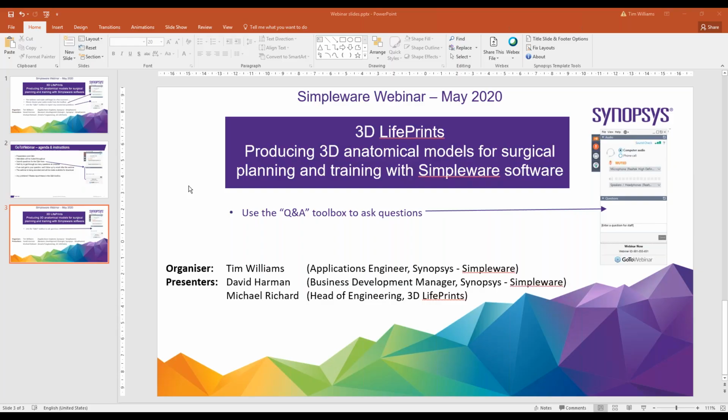Well, certainly, yeah, I can speak on that a little bit. The 3D Wrap tool really works on the basis of segmenting individual images in two different planes, with obviously a large gap in between those segmented slices. Then, utilizing the tool itself, you're able to wrap in 3D around the sort of skeletal structure that you've created for that segmentation, and then the bounds of that segmentation will be kept.